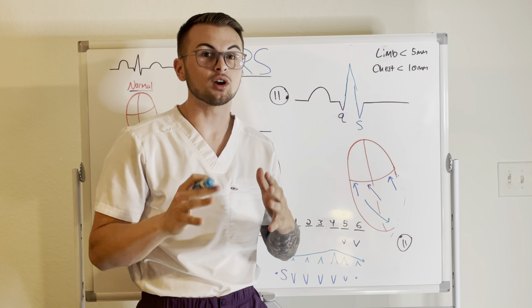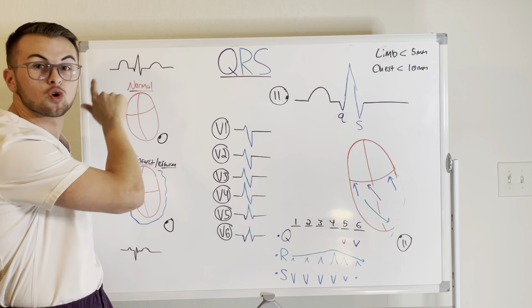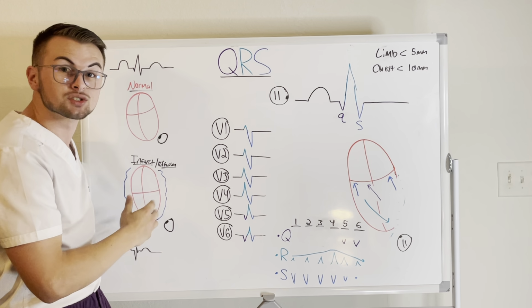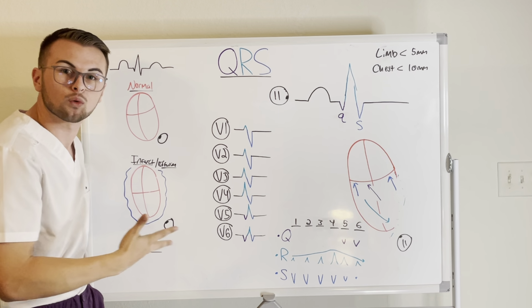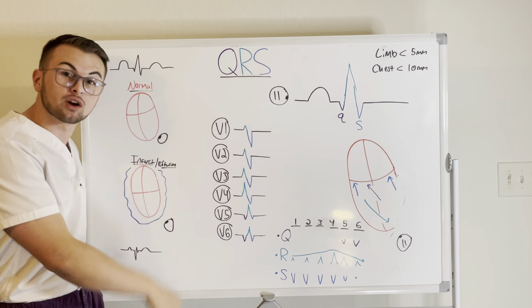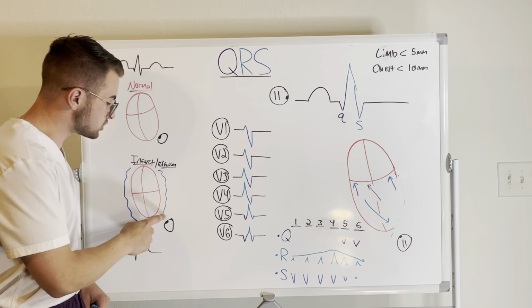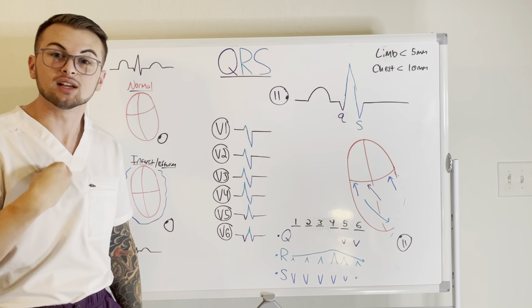Now, we also have to consider the pericardium. Imagine that in the first EKG, our patient has a normal amplitude for all of his tracings, and now we simply have too much pericardial fluid, or fluid that is surrounding the heart. This is called a pericardial effusion. So his heart is still generating the same electrical force, but these electrical vectors are having to travel through an ocean of pericardial fluid. It should be no surprise to us that when our patient's EKG tracing comes back with smaller amplitudes, it is due to the sheer distance that these vectors have to travel to be seen by our EKG leads.